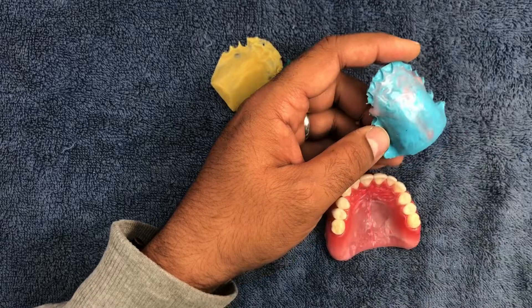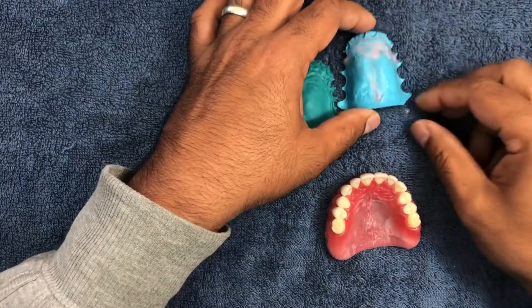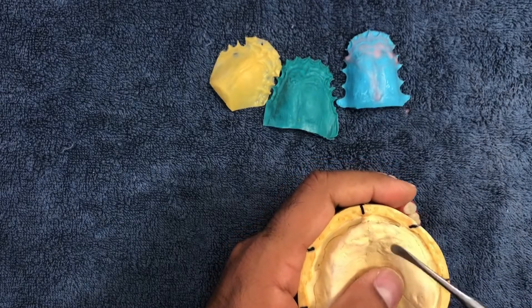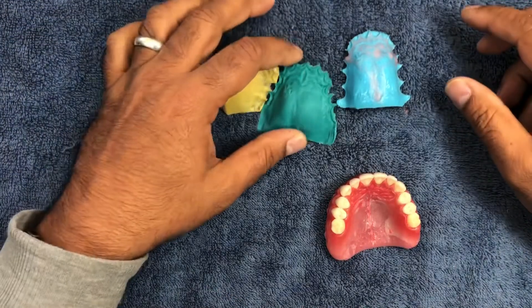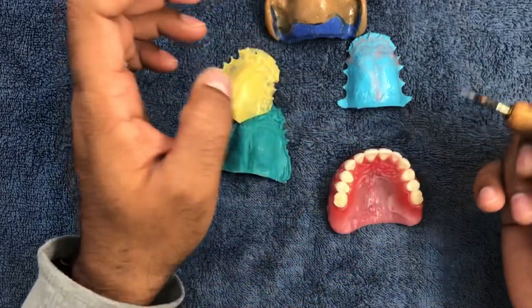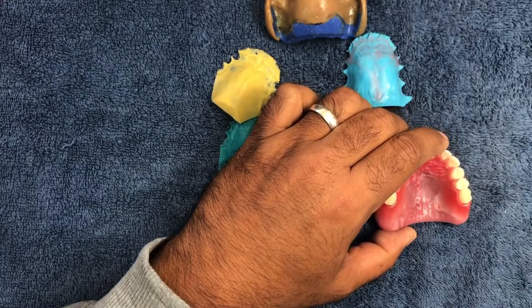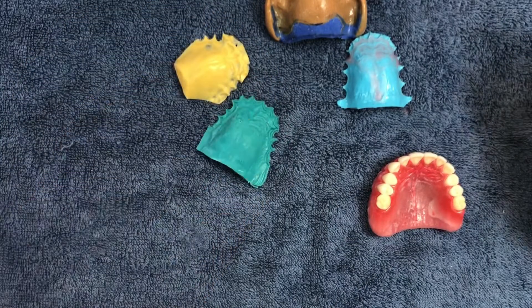This is what I do to duplicate the same anatomy of the palatal tissue. But if the palate has lost its definition — the rugae, incisive papilla, mid palatine raphae, everything compressed and lost due to overuse of a denture or other reasons — we can use our imagination or look at old models and try to replicate the anatomy freehand. I encourage people to try it, see how they do, and keep going — don't get discouraged.